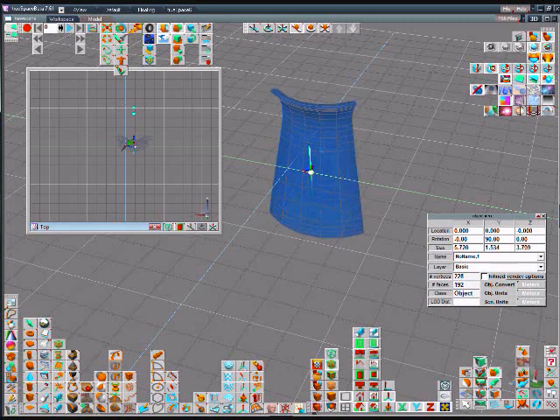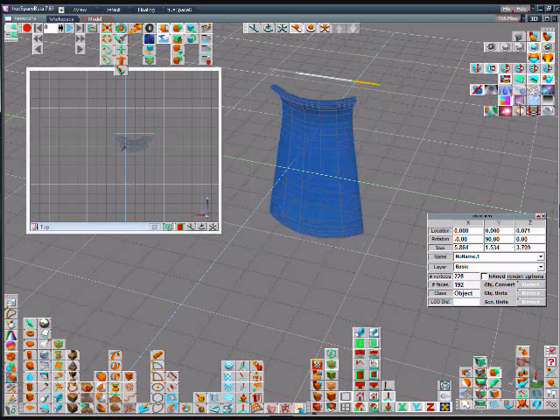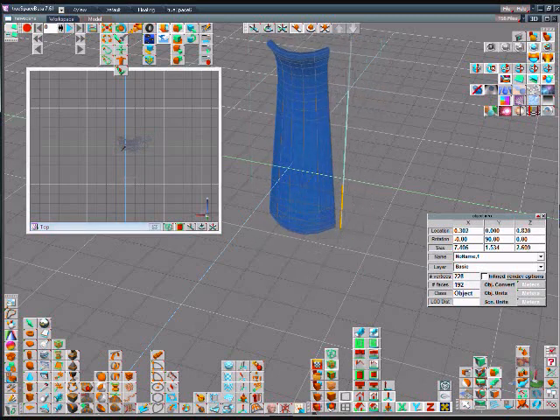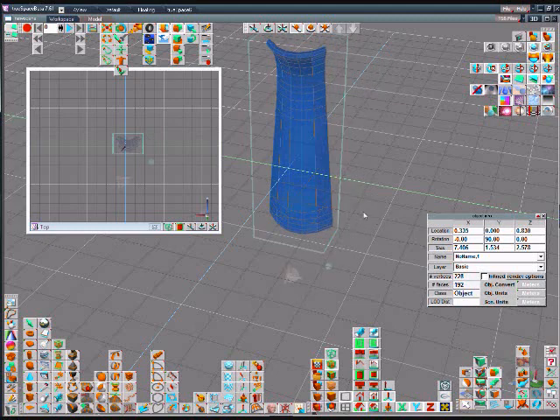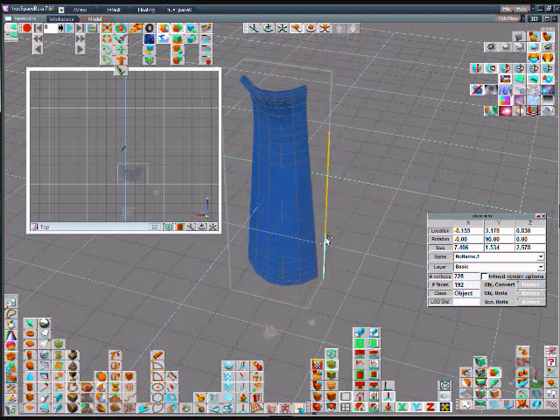We can also use a skew to skew it out at the bottom or the top to make it thicker or thinner at the bottom or the top.